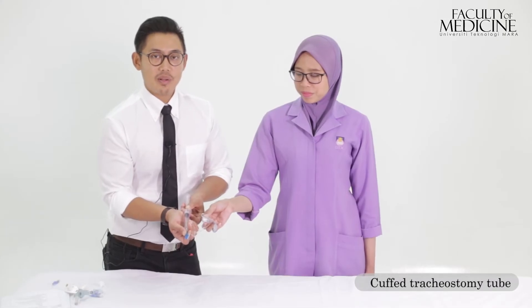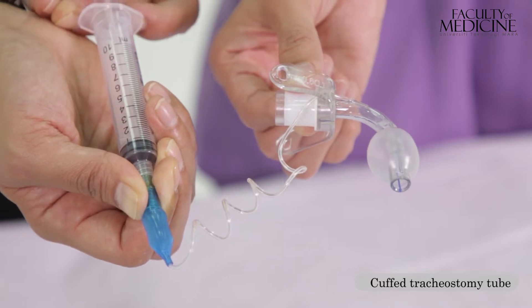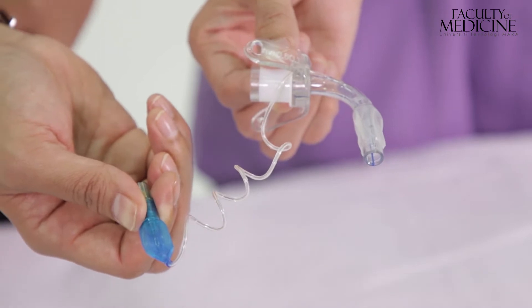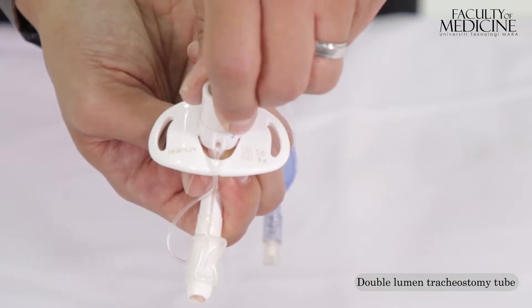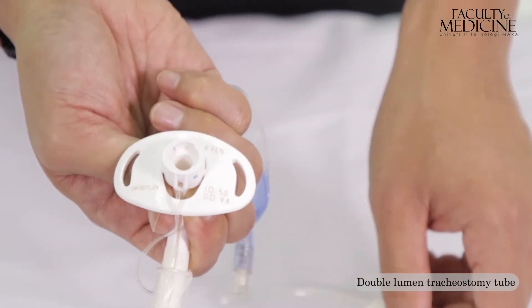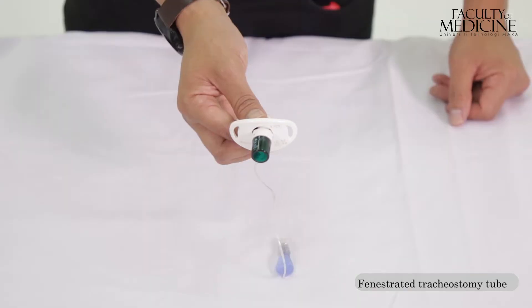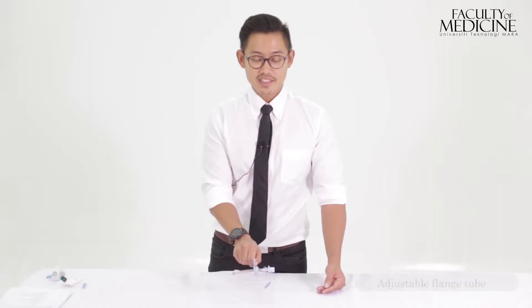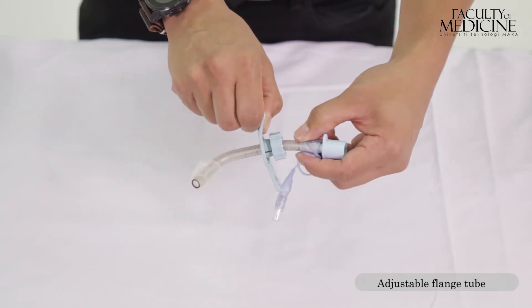The tracheostomy tube has an inflation port, which is used to fill air into the tracheostomy cuff, and this enables a good seal to be produced when the patient is ventilated. The double-lumen tracheostomy tube has an inner and outer tube. The inner tube can be removed and replaced with a new one when it is dirty. Some tubes have a fenestration and this enables the patient to speak. An adjustable flange tracheostomy tube enables adjustable lengths to be used for the patient according to their requirements.